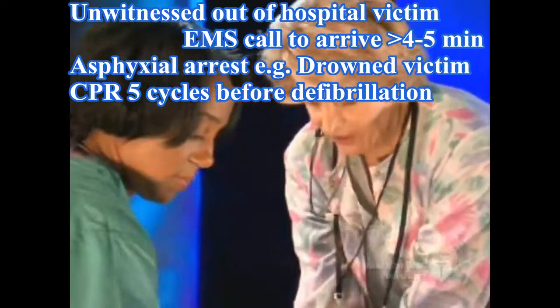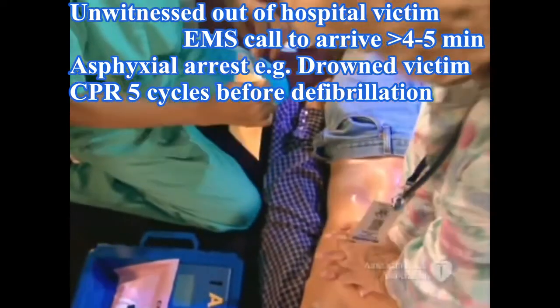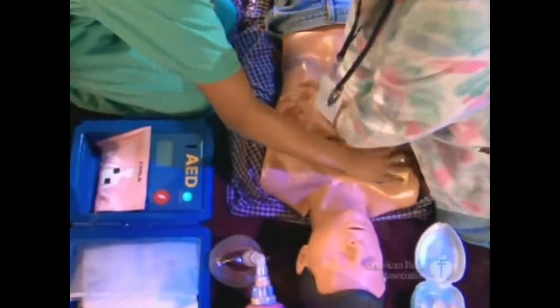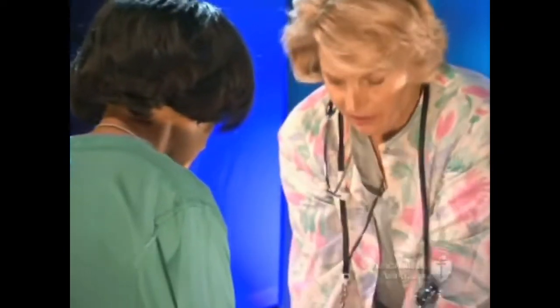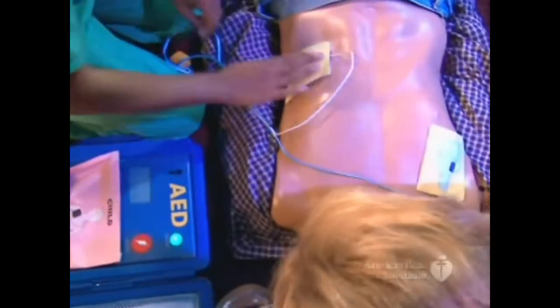Apply pads to patient's bare chest. Open the AED pad package and peel off the plastic backing. Press the sticky side on the victim's bare chest. Place one pad on the upper right side of the bare chest to the right of the breastbone. Put the other pad a few inches below the left armpit.